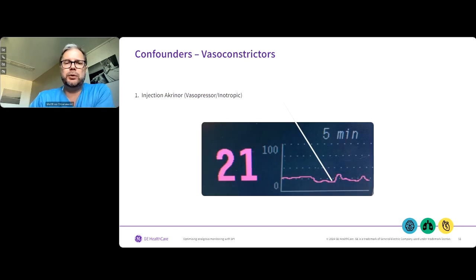Okay, before I come to the conclusion, of course, I've now talked much more about overdosing than underdosing, but of course, underdosing is also an issue. From my clinical experience, we've had trauma patients with a high use of opioids, which could be very easily detected by using the SPI monitors.